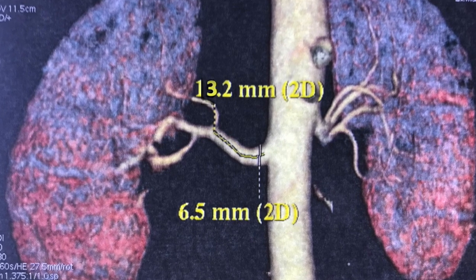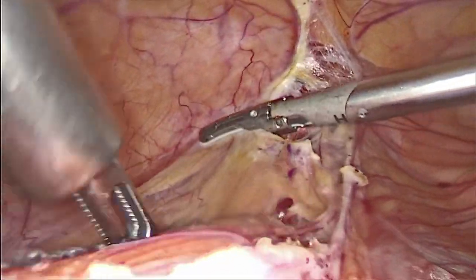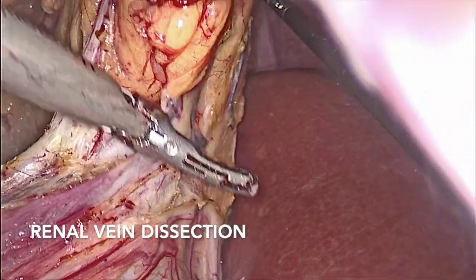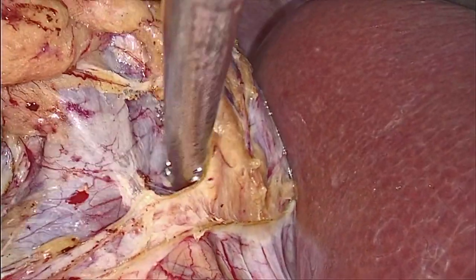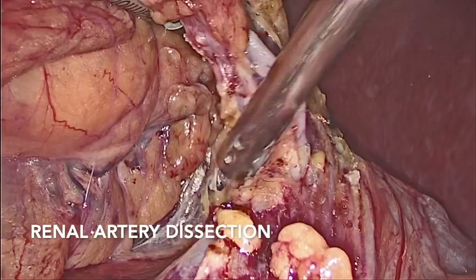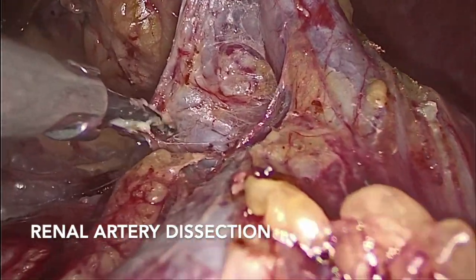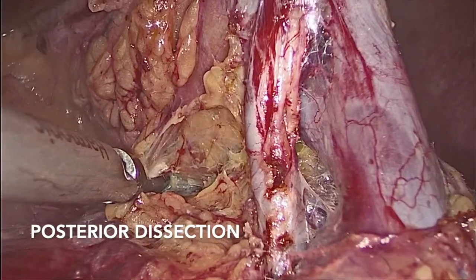Now let us see a case of right lap donor nephrectomy with early branching. Routine steps of dissection done. Hilar dissection being done. One branch of renal artery exposed and being skeletonized. Posterior dissection being done to completely skeletonize the artery.